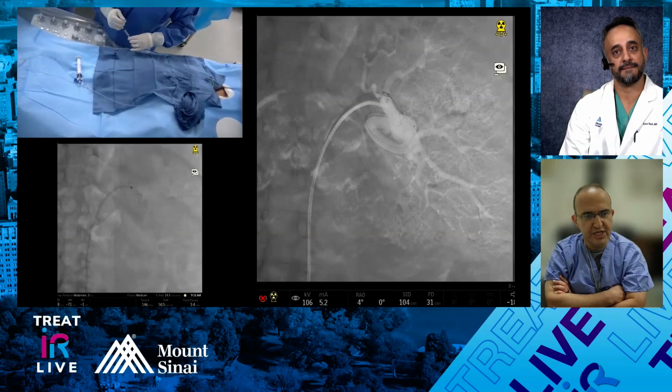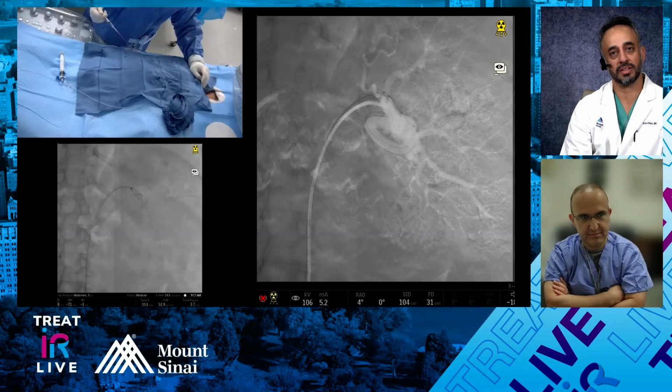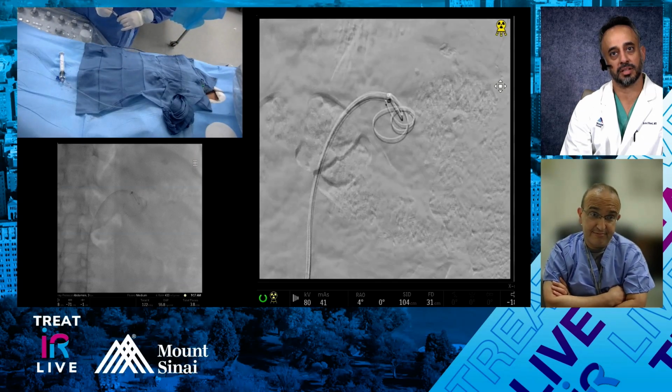While we're chatting, I decided for fun to go into the outflow vessel, but again, I'll leave it up to discussion. Do I need to go into the outflow vessel here? Are we sufficient with just coiling the sac, or should we coil back?